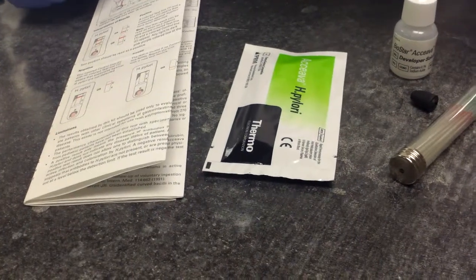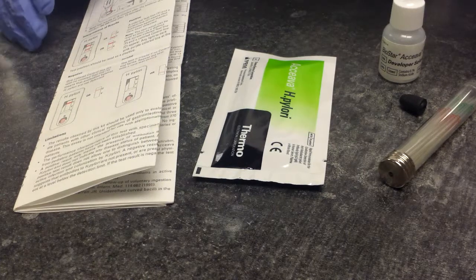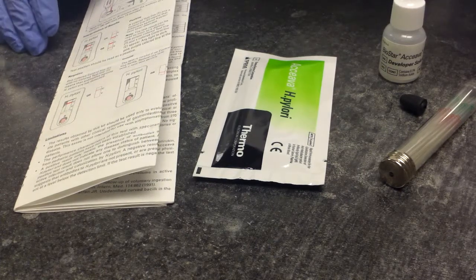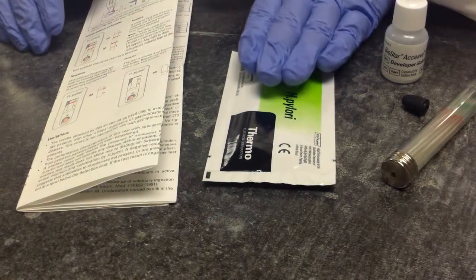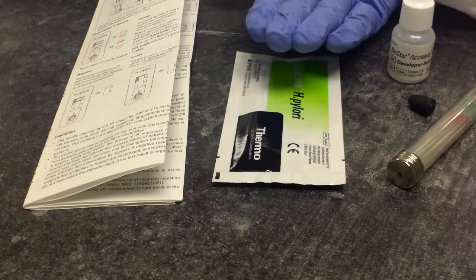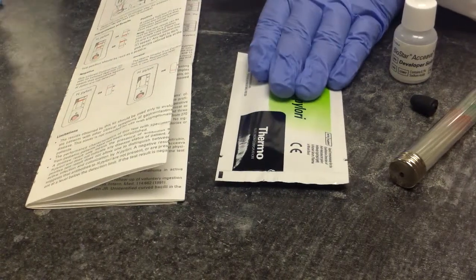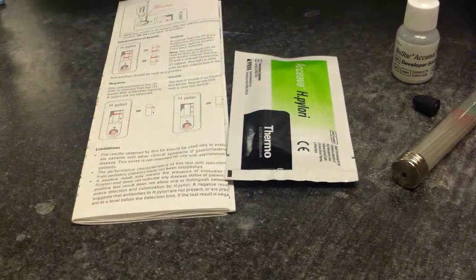This is an EIA test for H. pylori, and we are looking for H. pylori antibodies, which means that our test cartridge is going to have a tagged H. pylori antigen. So our specimen has the antibody, our test kit has the antigen. The test kit contains everything you need in it.